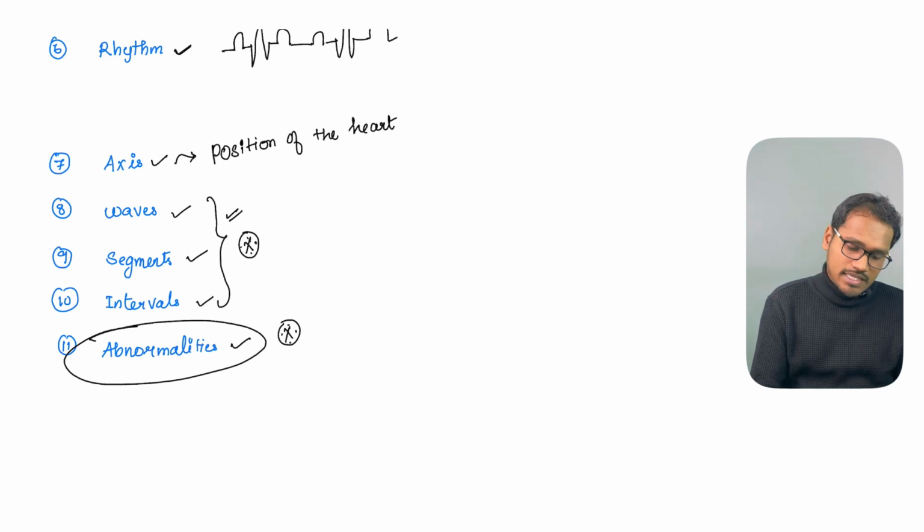So we are going to make separate videos on the heart rate calculation, axis calculation, and various other abnormalities.